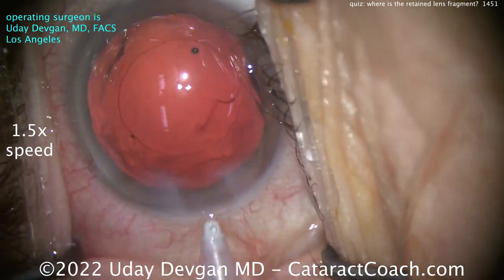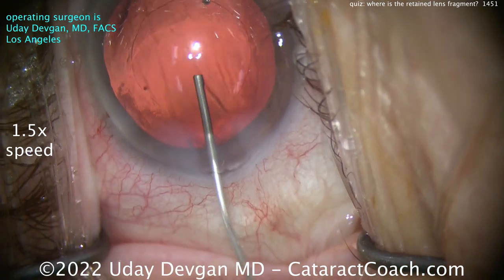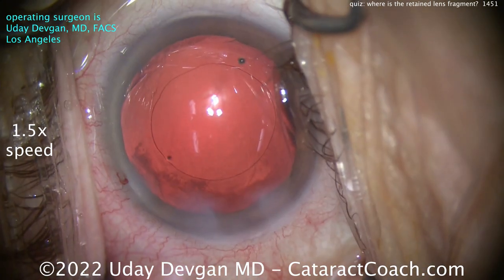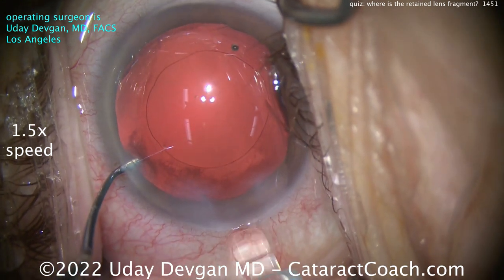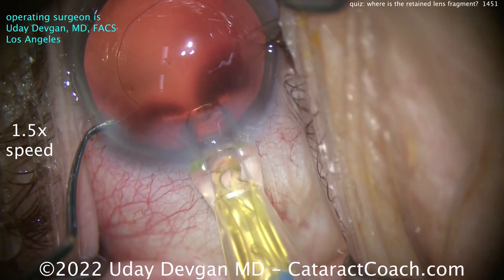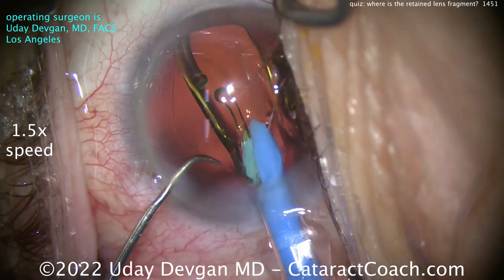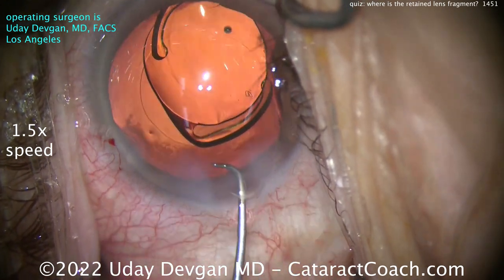I don't see any pieces — do you? Look carefully. Not really. Viscoelastic going in, let's fill up the capsule bag and polish up the capsule more. Here comes the lens — a single-piece acrylic lens — going right into the capsule bag. Nice and easy, delivering it in and letting it unfold.